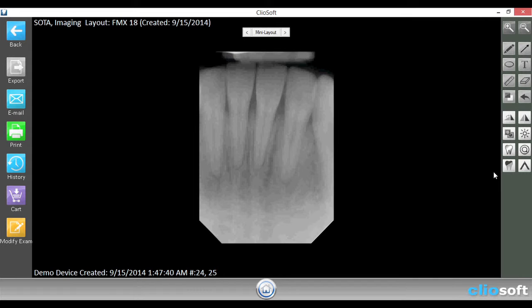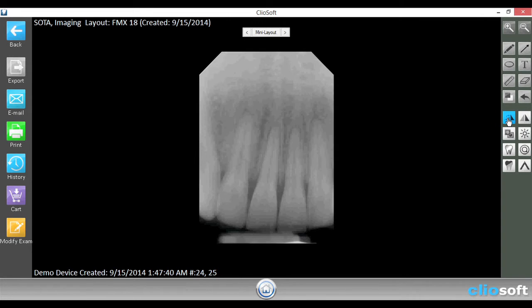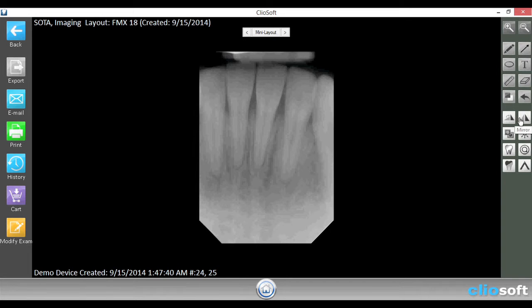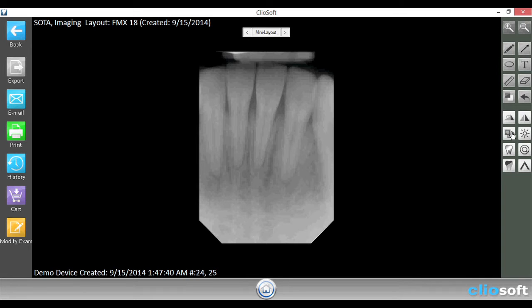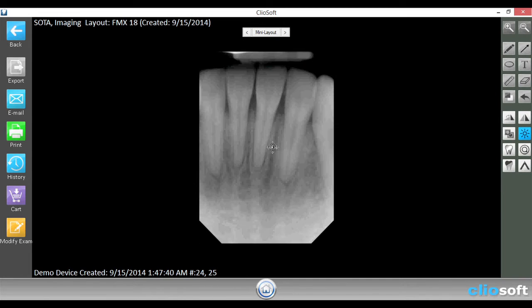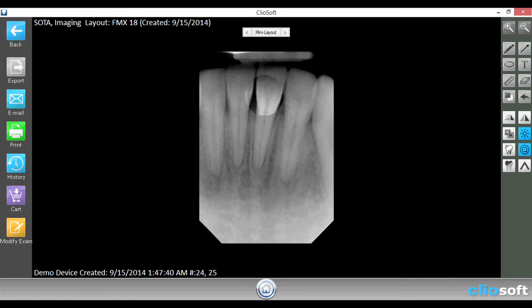Now let's go over to the filter side. We can rotate our image, we can mirror the image, we can invert the image. We can change the brightness and contrast by simply left-clicking and holding on the image, then adjusting up or down for brightness and left to right for contrast. We can also colorize the image, and we have our spotlight filter, which will compare and contrast only the image in the circle.